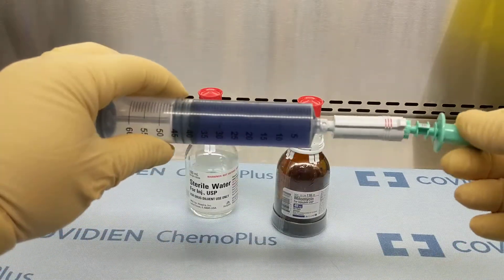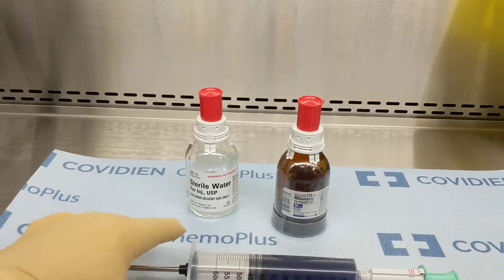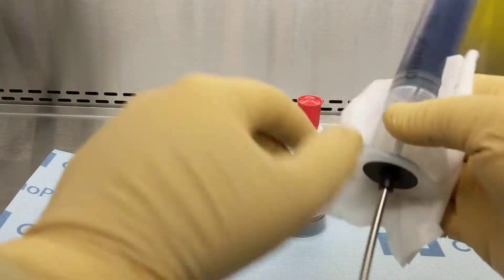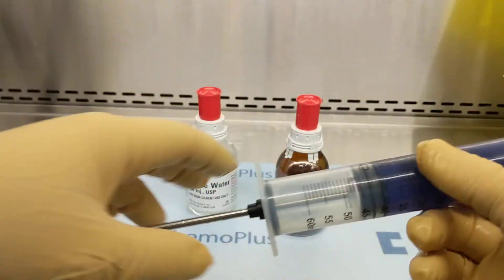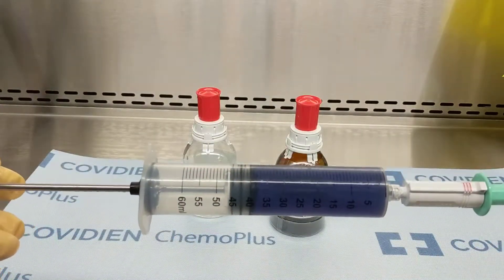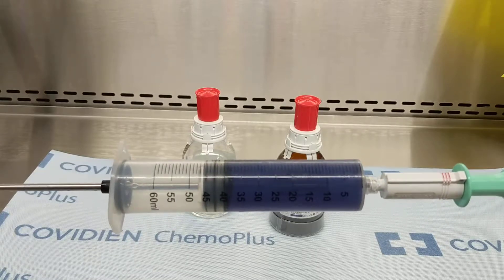Deactivate and decontaminate the syringe using a low-linting wipe saturated with Peridox RTU. Then dispense the syringe with an Equashield catheter adapter.